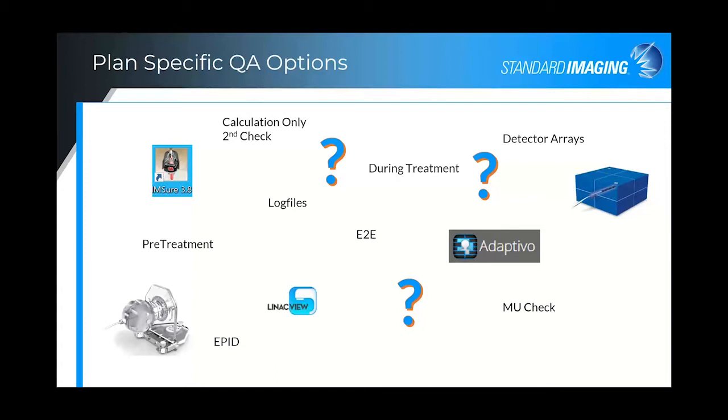For an overall view, end-to-end testing is very important. Multiple presenters at this past summer's virtual AAPM annual meeting suggested that with increased complexity of treatment workflow, physicists should consider performing end-to-end testing on a more regular basis rather than just when starting a new program or commissioning a new system.